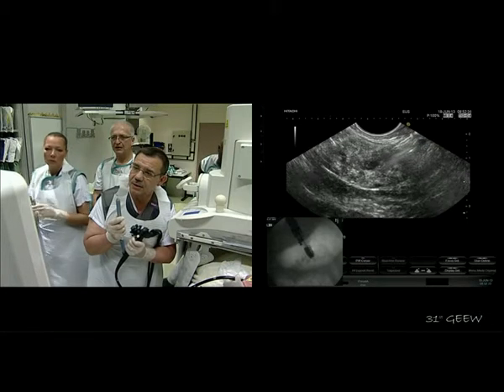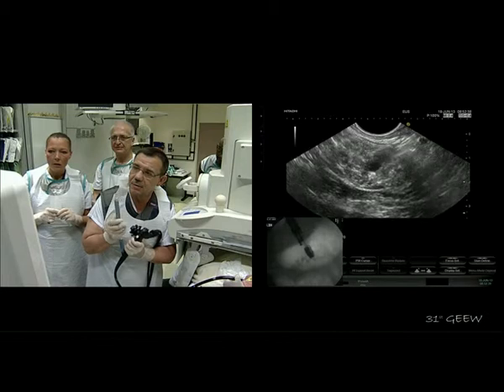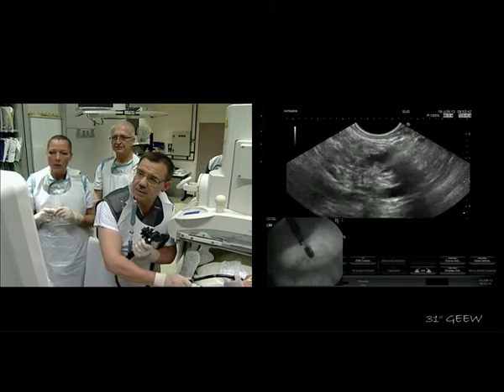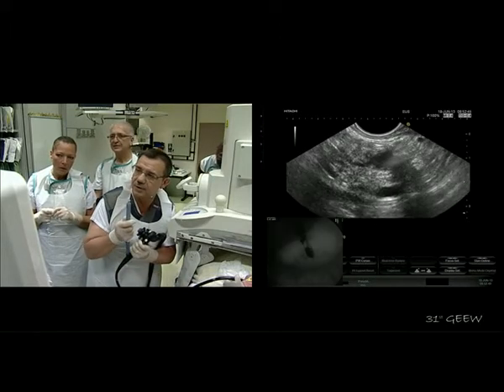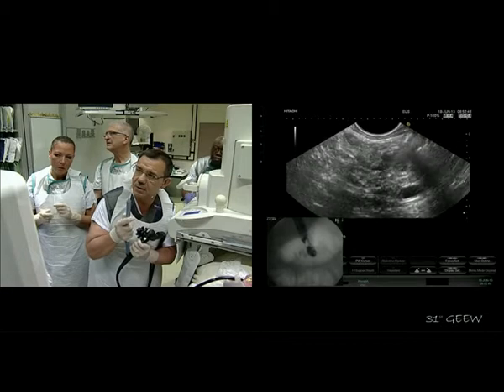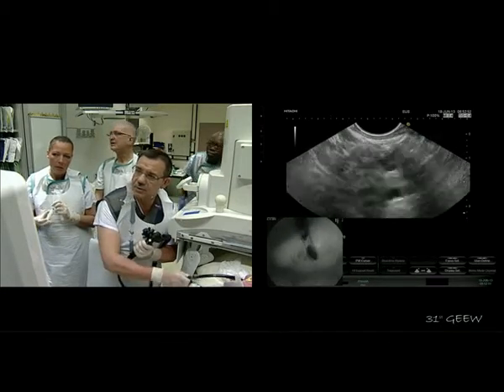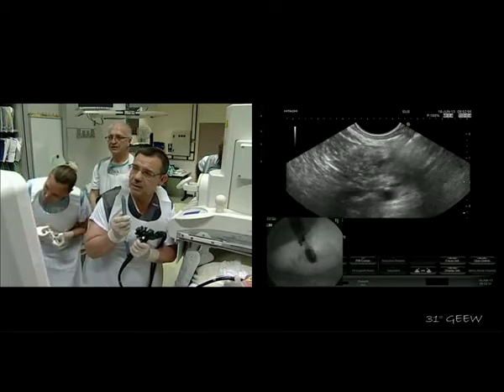Okay, I think. You think you're in? That will be better if I go in this direction.